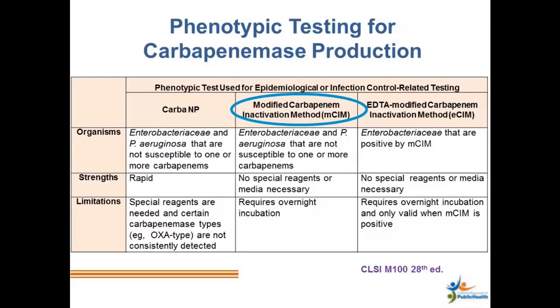However, like Stephanie mentioned, it becomes essential when the antimicrobial resistant isolates carry genes other than the gene targets included in the molecular testing, such as Xpert Carba-R. So in conjunction with molecular tests, phenotypic tests could identify rare or new antimicrobial resistance mechanisms. Three phenotypic testing methods listed on the slides are currently recommended by the Clinical and Laboratory Standards Institute, or CLSI. Each one has its pros and cons.